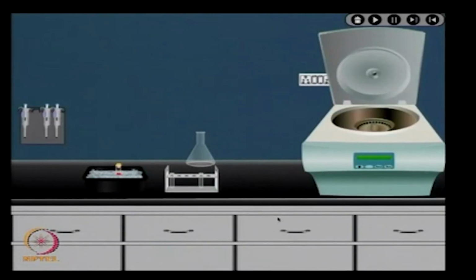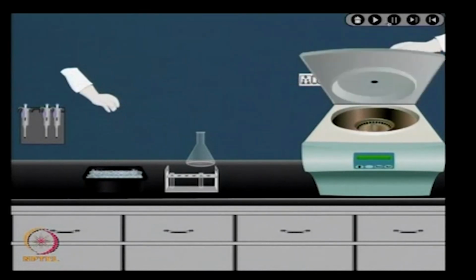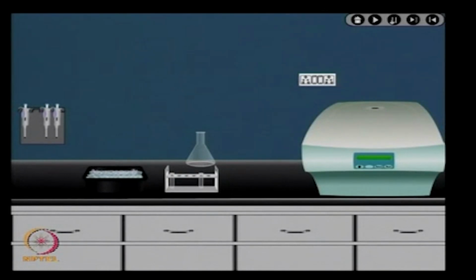It fluctuates depending on the physiological and pathological conditions of the patient. Collect almost 5 ml of blood from the vein of healthy or diseased participants using serum separation tubes. Immediately after the blood collection, the tube should be kept in ice for 30 minutes for clotting.